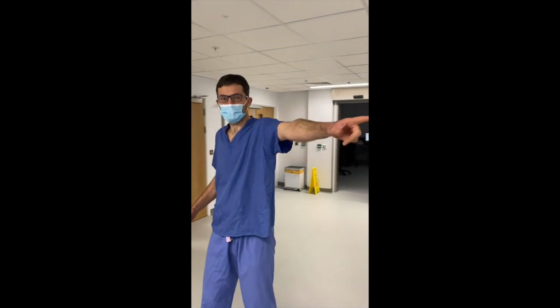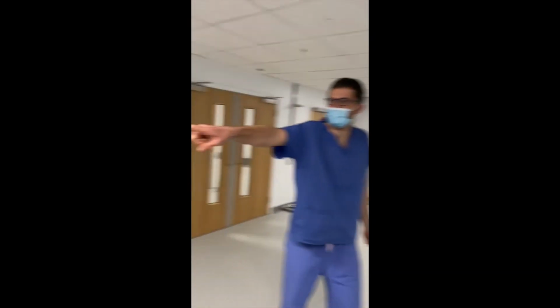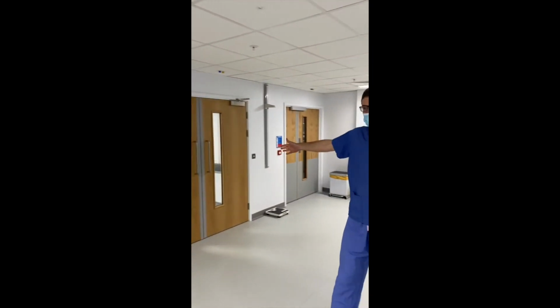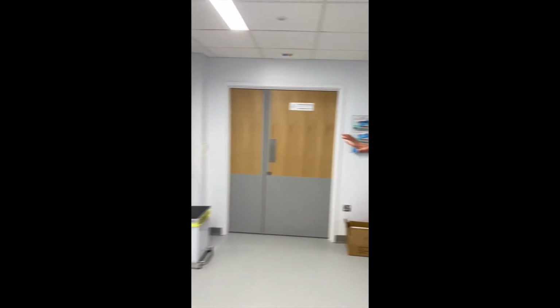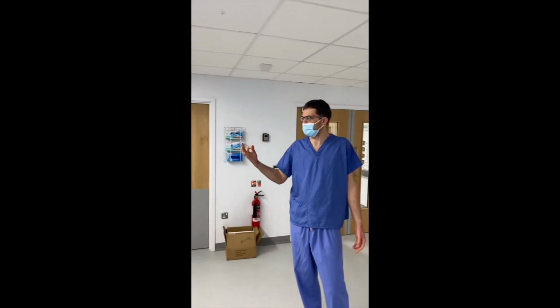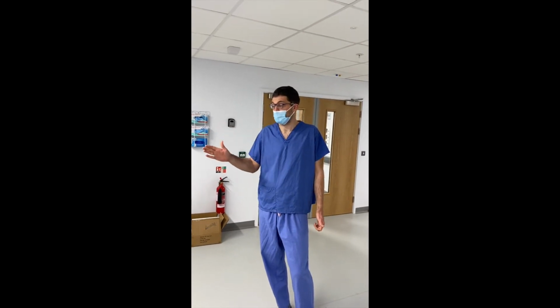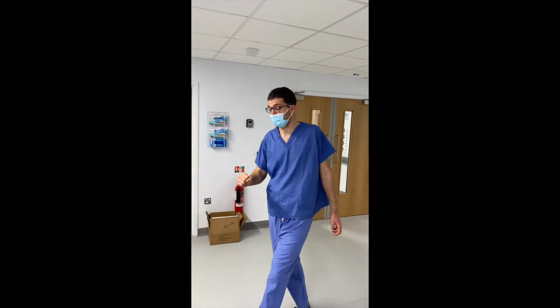Through that door there is the MRI scanner. Behind that door there is the MRI control room, and through there is the anaesthetic room. This is the entrance door you'll have just come through. That door to the MRI control room has to remain closed at all times with a red, amber or purple patient out here. Some of the MRI staff should be at home shielding, but have elected to come to work, and we have to respect their safety and not open that door, please.